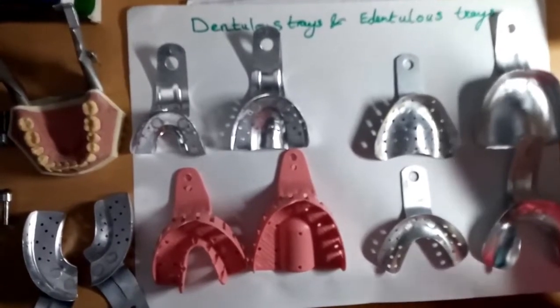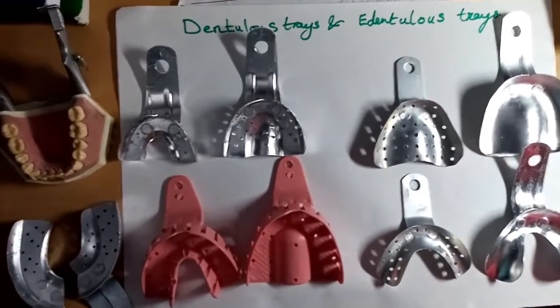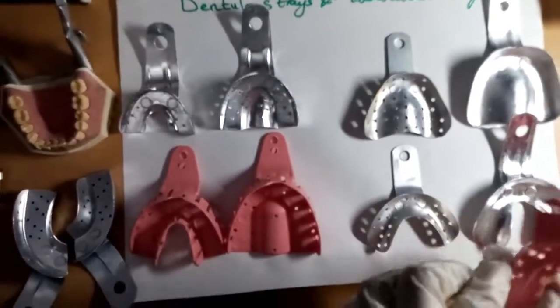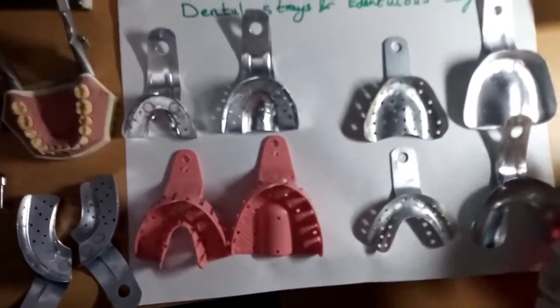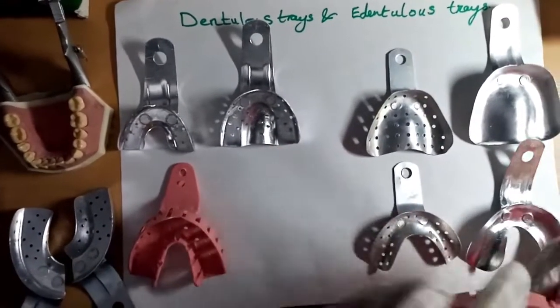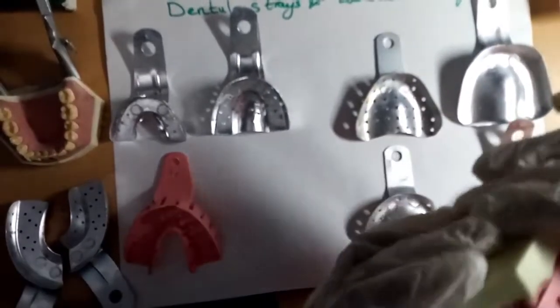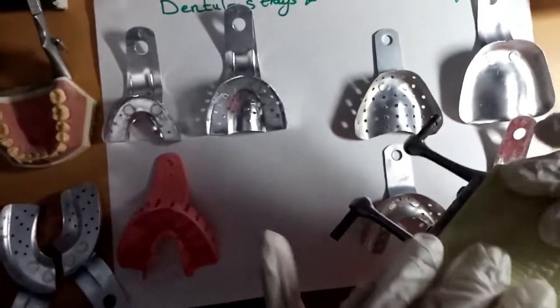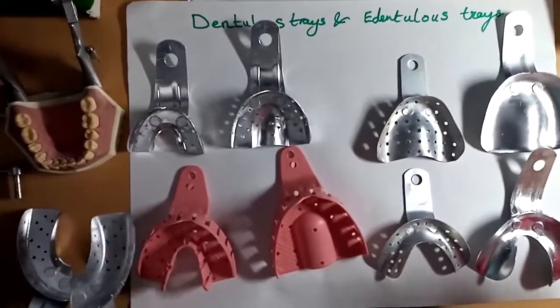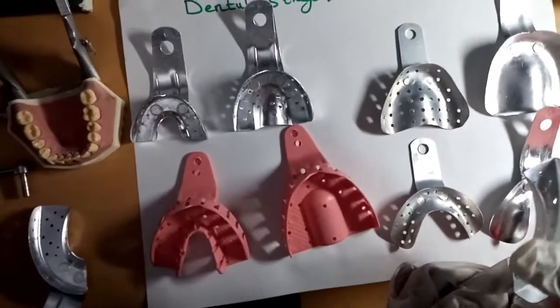And finally, sizes. There's another classification, which is according to sizes: small size and large size. Here, this is number three, and we have here number two, and we also have number one. This depends on the jaw size of the patient. We have to check the size of the impression tray in the patient's mouth, if it's appropriate or not. Each patient uses a different size of impression tray. We call these partial impression trays, or sectional. Some are made of plastic, and they are single use.